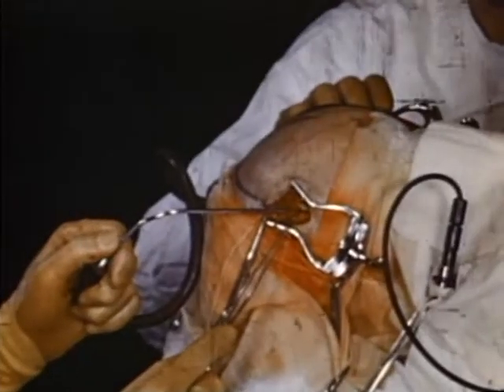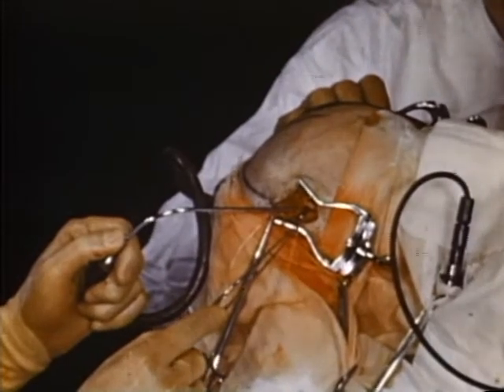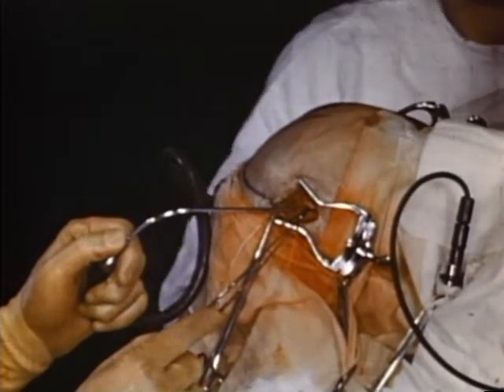The surgeon starts on the second side, inserting the leucotome through the incision where it can be seen coming out on the surface of the brain. This shows the delicacy and accuracy of the method.